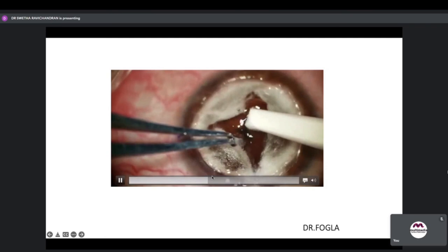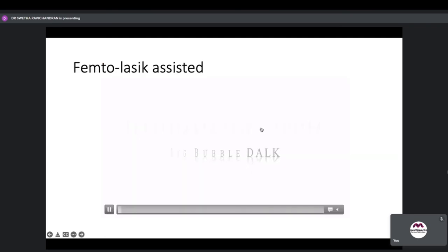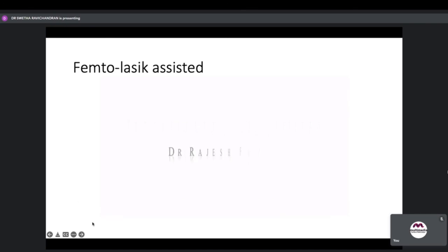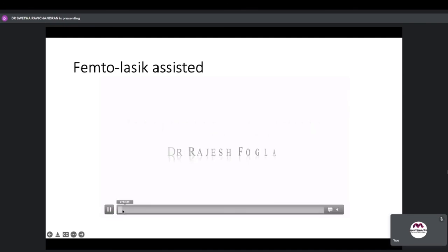The idea of the final video segment was to show the opening of the bubble — also demonstrating that femtosecond laser-assisted DALK is another option for the procedure.